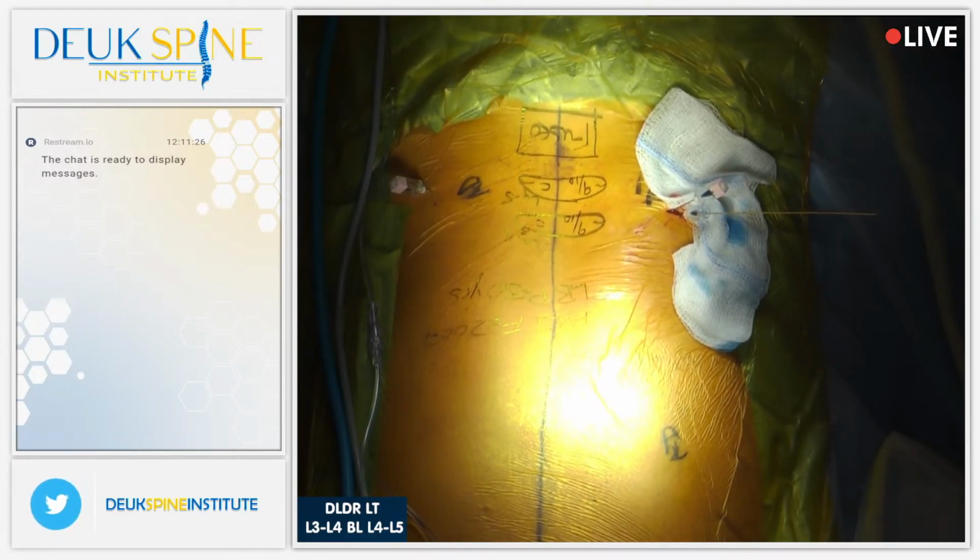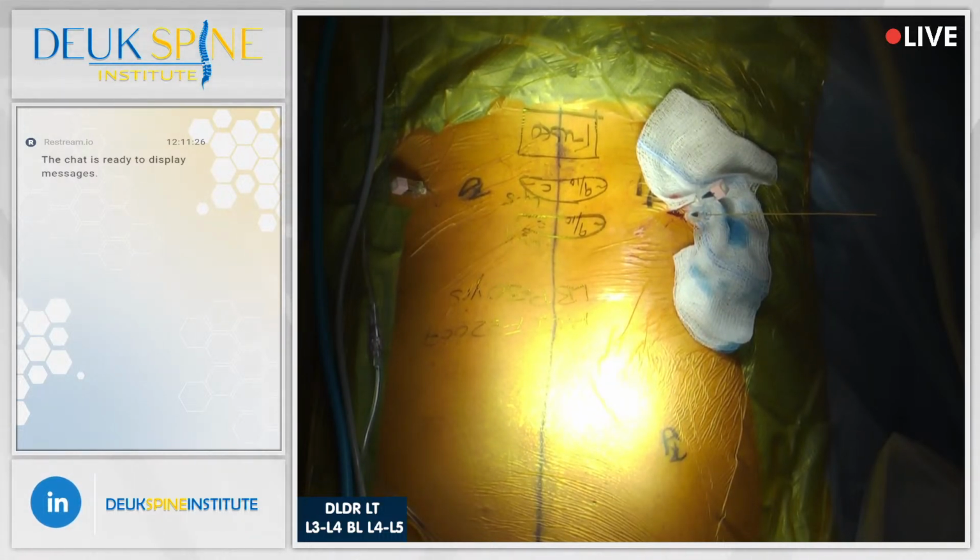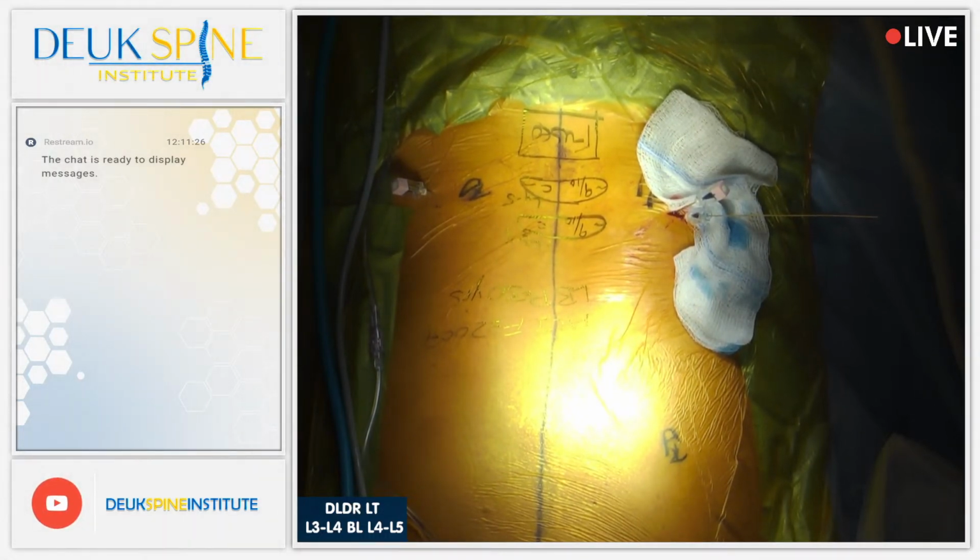Acidic is not a sect of Jewish culture. It's actually acidic as in the pH is less than 7.4. Acidic, not Hasidic. And the dye will stain to the degenerated nucleus pulposus. So you're going to see it stuck inside the tear. The tear I'm talking about is the annular tear in the back of the disc.